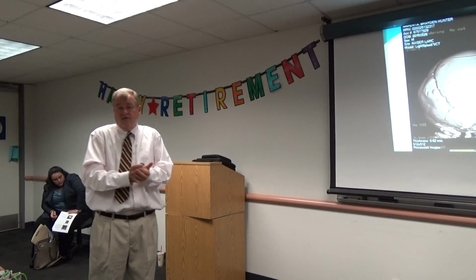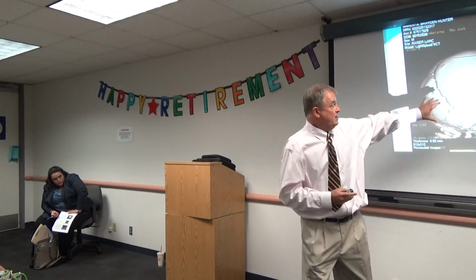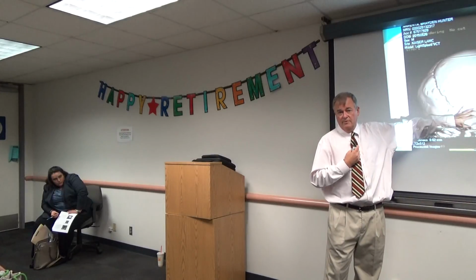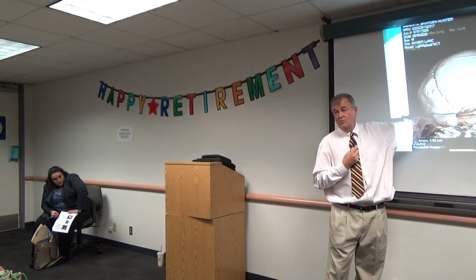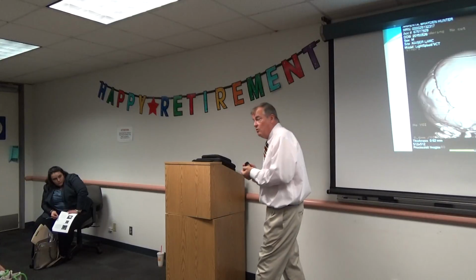A lot of times, when you send me stuff to look at, or any expert, and you send me the CT scan, depending on which hospital they went to, if they don't do this reconstruction, we're a bit of a disadvantage. I can just tell you what I see. I can't tell you what I don't see. If they do the reconstruction, it's very impressive how we can be much more assured of what we're trying to determine.